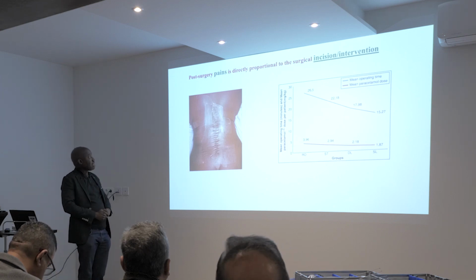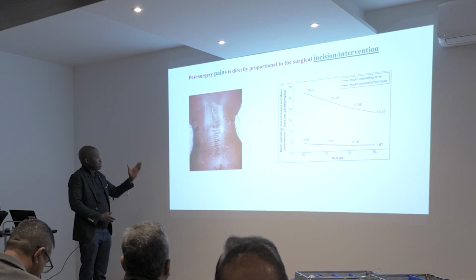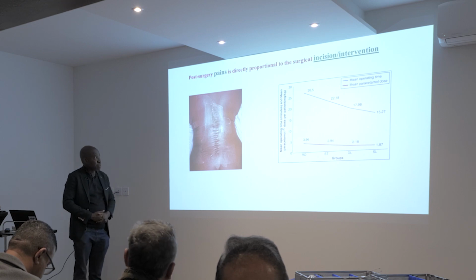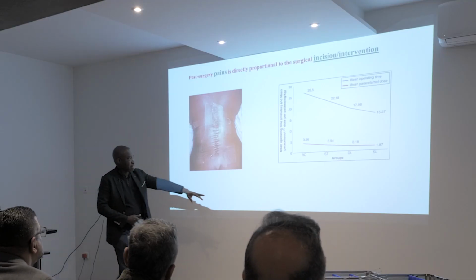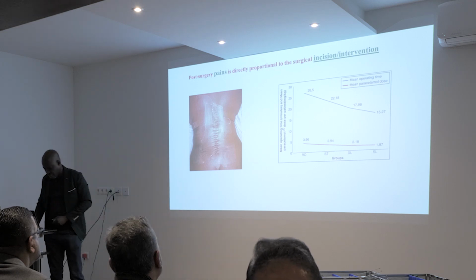Again, why are we all going into endoscopy? As surgeons, we know post-surgery pain is directly proportional to the surgical incision and the intervention. This is a study that I did myself, and I found out, yes, that's how it is.